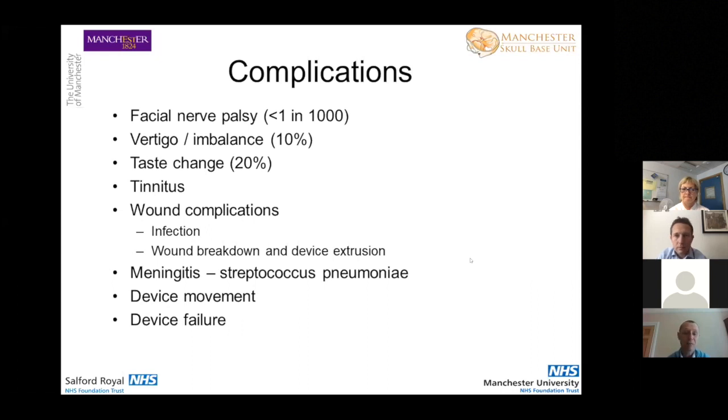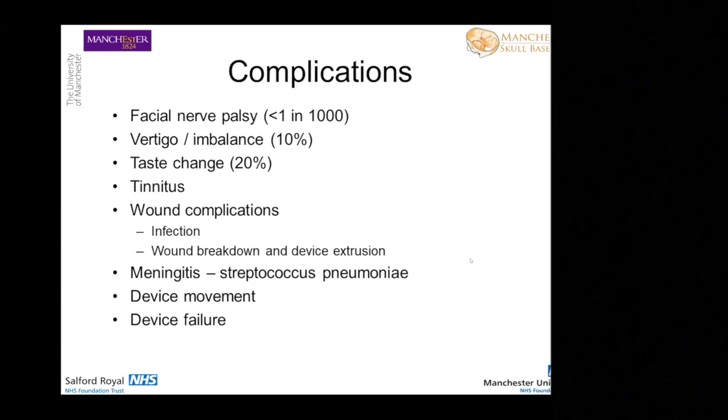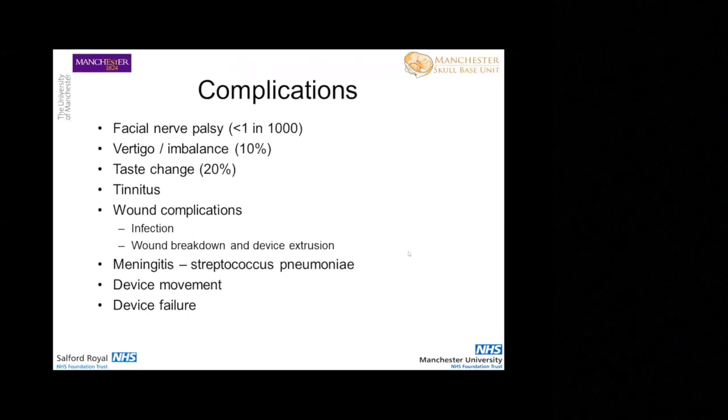And then finally, unfortunately, we do our best to hold the device down and get it in the right place and hold the electrode down, but occasionally these things move, and that's why we do the post-op x-ray, and occasionally we have to go back in and either move it back or replace it.